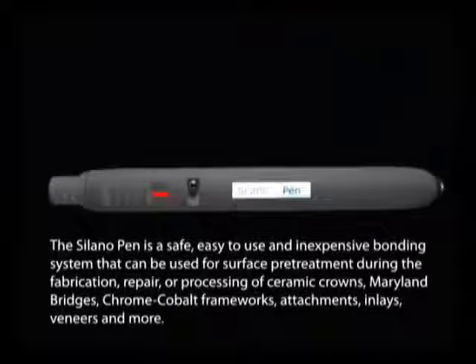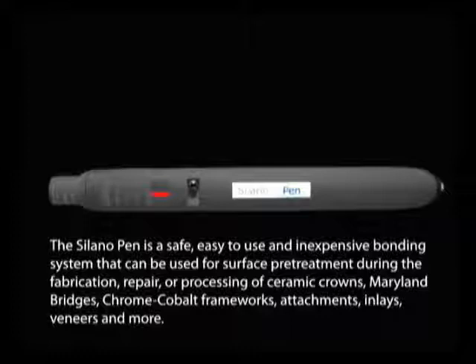The Silano Pen is a safe, easy to use and inexpensive bonding system that can be used for surface pre-treatment during the fabrication, repair, or processing of ceramic crowns, Maryland bridges, chrome cobalt frameworks, attachments, inlays, veneers, and more.